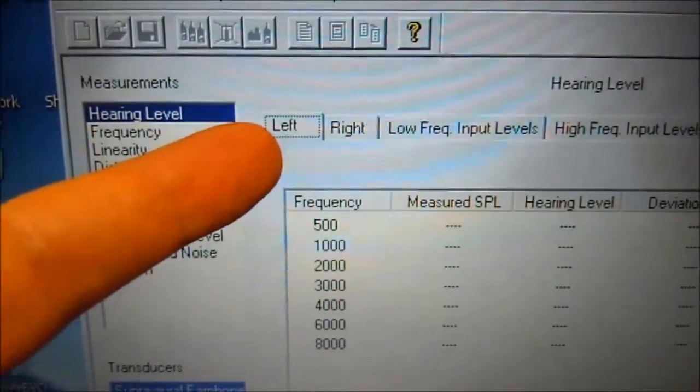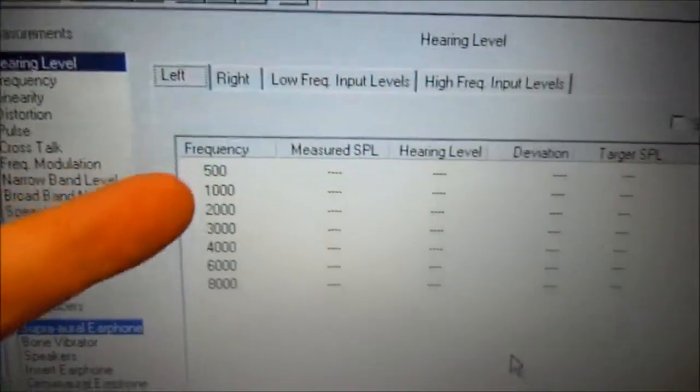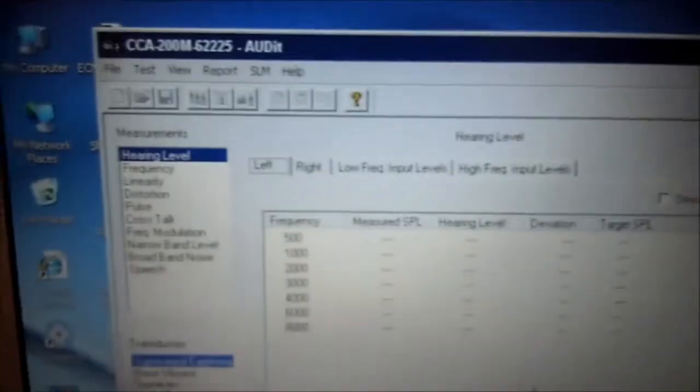Hearing level test. We're going to set up the left ear and the right ear, and we're going to measure these different frequencies. So let's set up the left ear now.